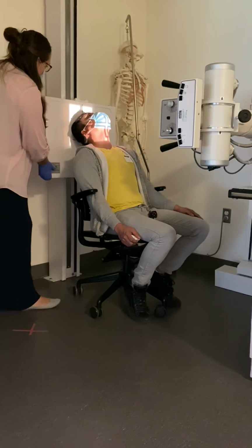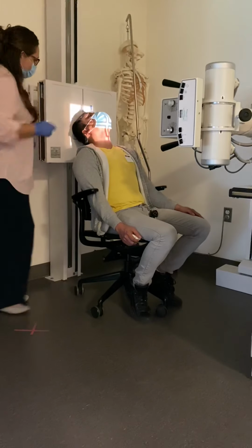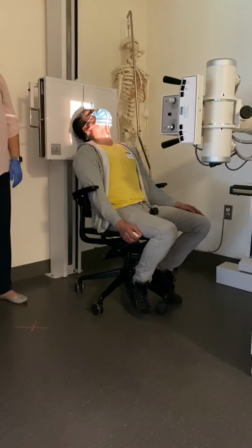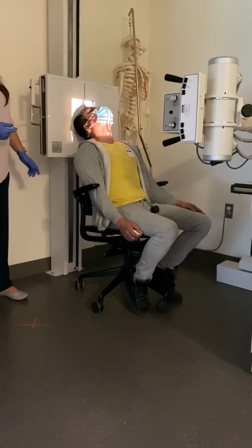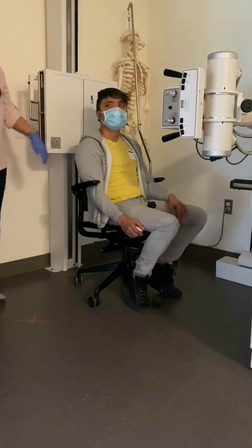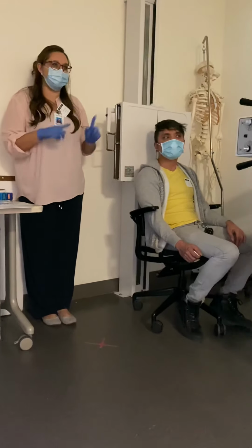This board's going to raise up behind you. And I'm going to just make sure that my marker's in there. Then I would have my patient again hold nice and still, don't move. I'm going to take that exposure and help them up when they're done, and you can relax. So that's it for mandible, but you're going to perform both axial laterals, the right and the left.